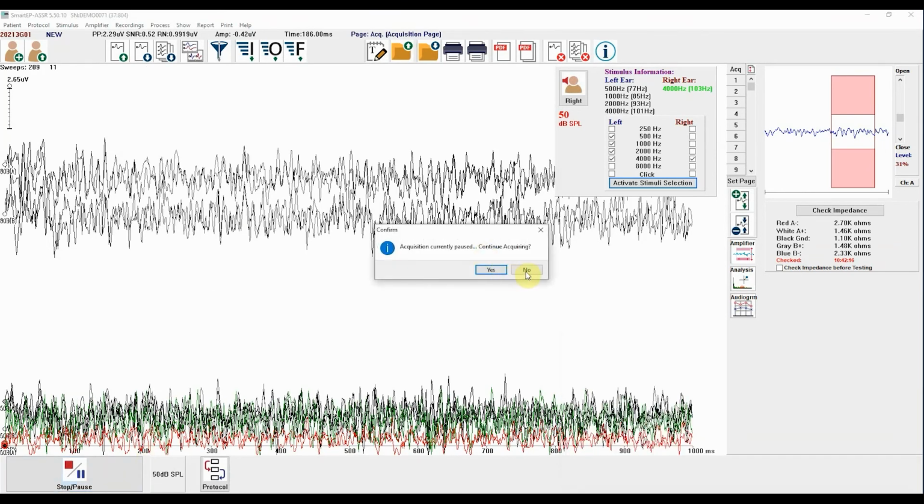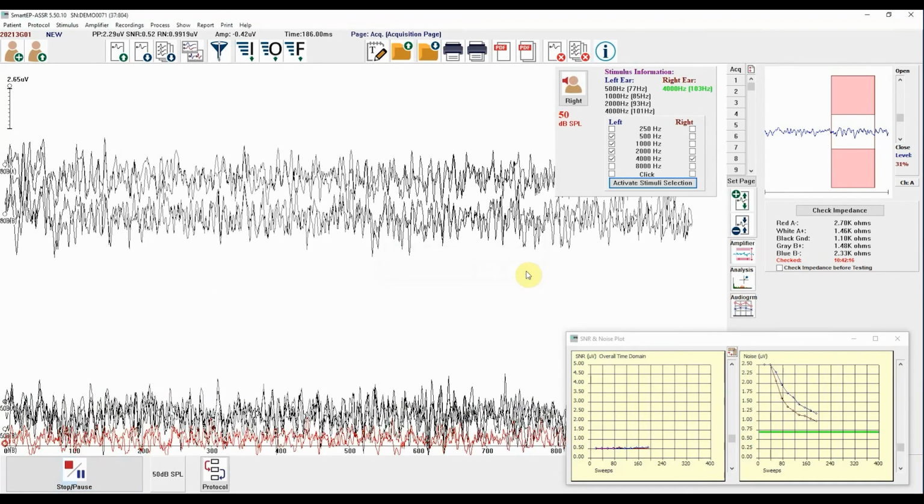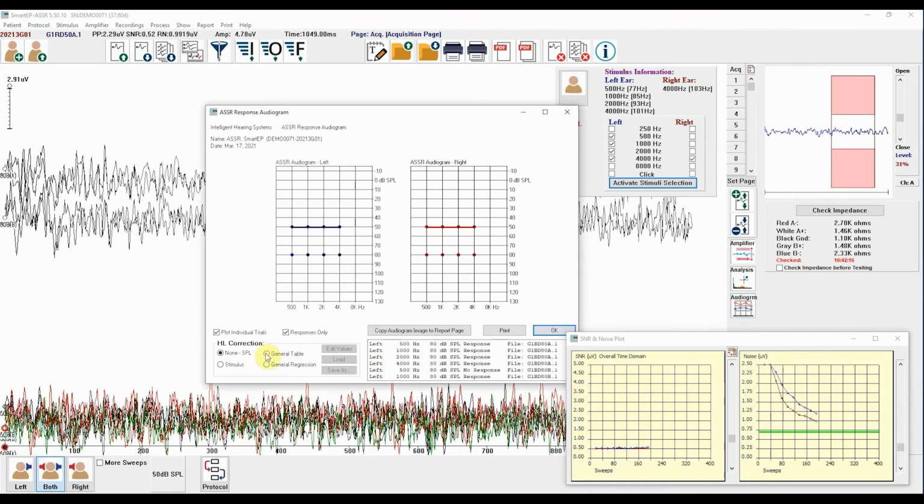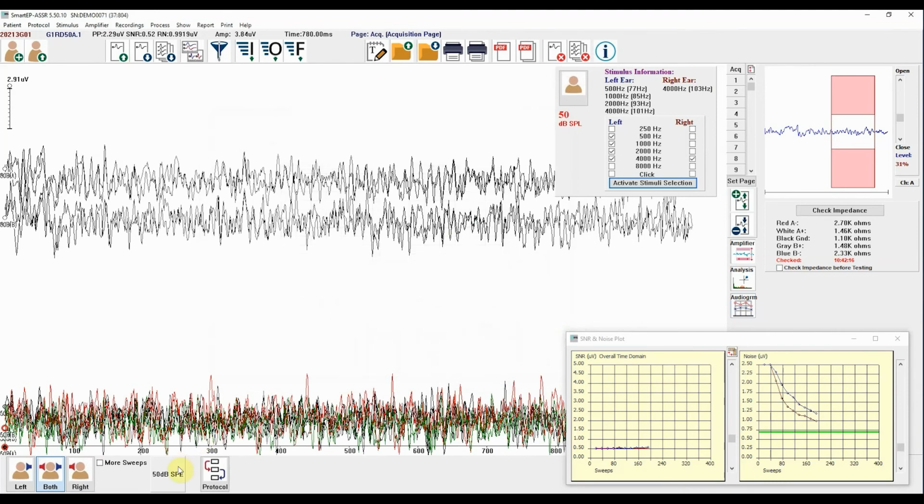Fill in the audiogram by returning to the frequencies that were previously taken out, or test them as single ear, single frequencies as you go. It is very common to take a single ear, single frequency approach at threshold levels. As a clinician, you can evaluate your data analysis screen and stop your acquisitions manually.